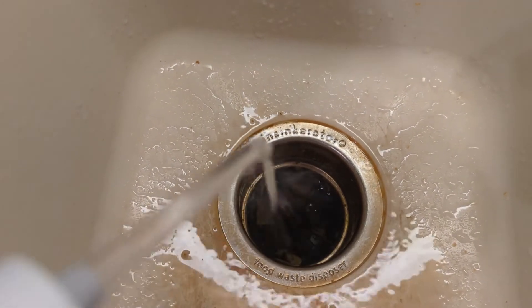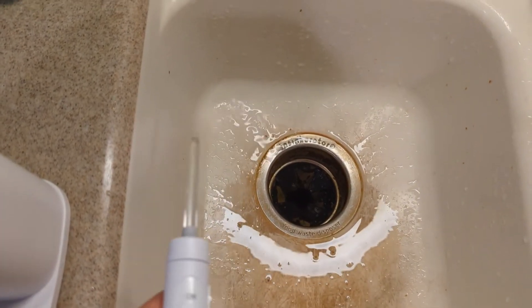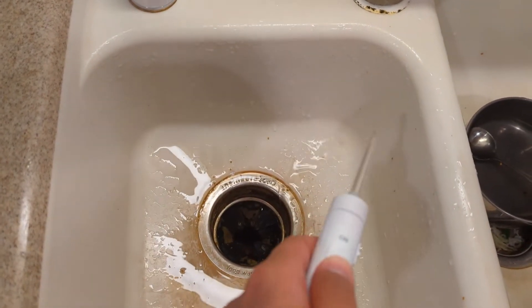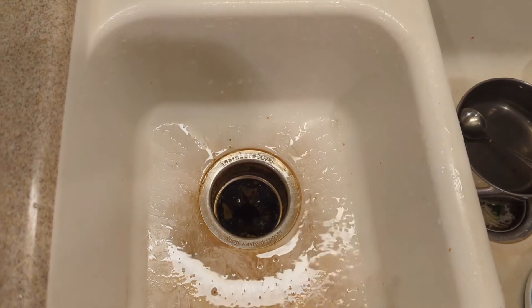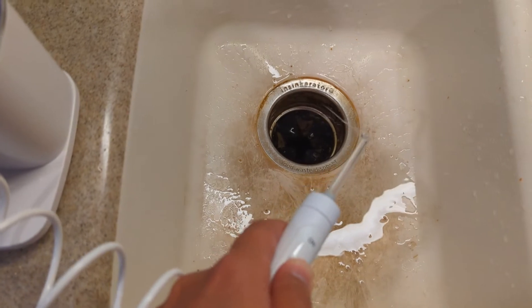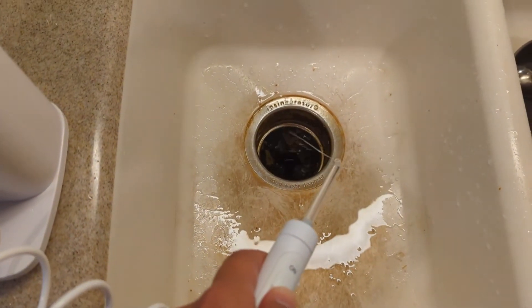I would start with maybe number two. Now this is number two — you see it's significantly weaker. This is actually the lowest setting. I just wanted to show you number two versus number 10. This lower setting is not going to clean your sink the way number 10 would.